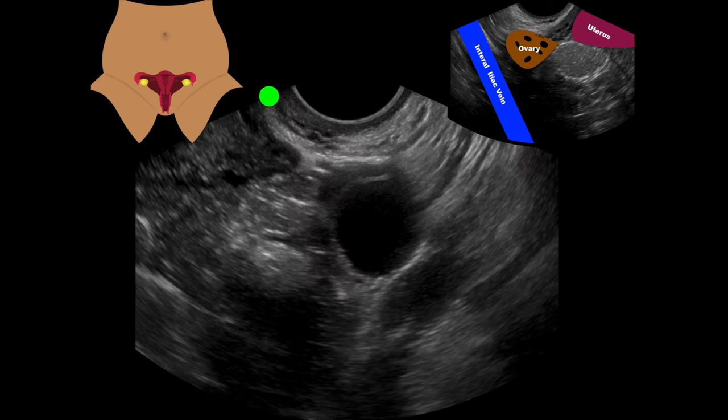If we angle over towards the patient's left, we can see in this image an ovary with a big cyst on it, and laying just adjacent to it are those iliac vessels again — that anechoic to hypoechoic structure. I'm going to look in that area for any pathology. This helps us understand whether we have adnexal masses or whether we're seeing the fallopian tubes and are concerned about pathology there.